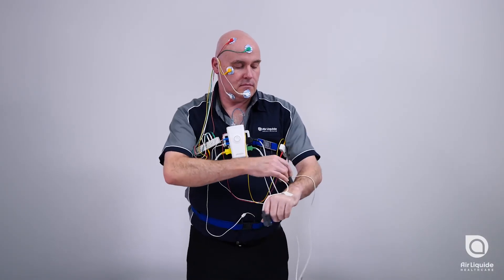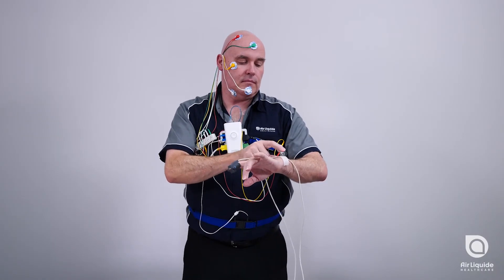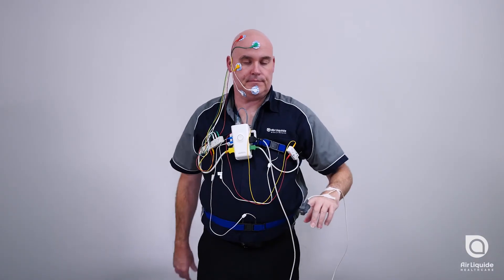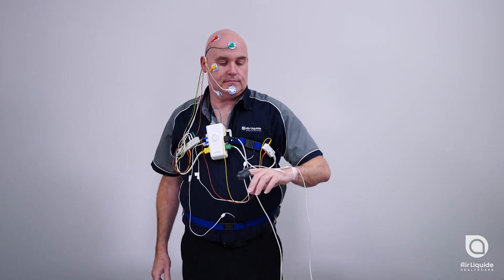Apply tape over the cord on the back of your hand and on your forearm, just behind your wrist. Ensure that you can freely move your wrist, but the sensor cannot fall off.